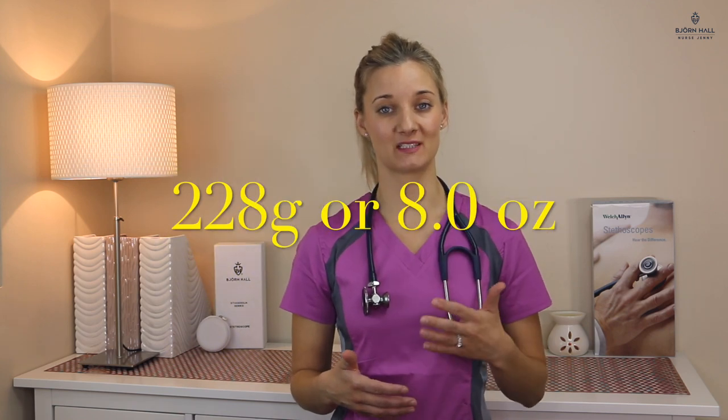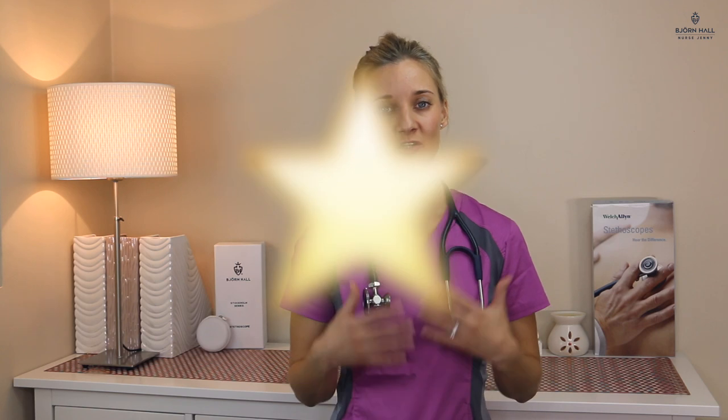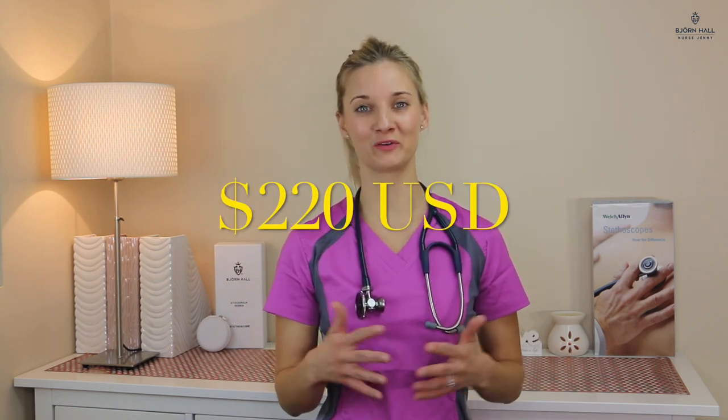Weight. This stethoscope weighs 228 grams which is about eight ounces, and for me personally that is way too heavy to have around my neck all day. So I've given it a one out of five. Price. I paid 220 US dollars for this stethoscope and I thought it would arrive with a lot of bells and whistles but it didn't. The value for money just isn't there for me, so I've given it a two out of five.